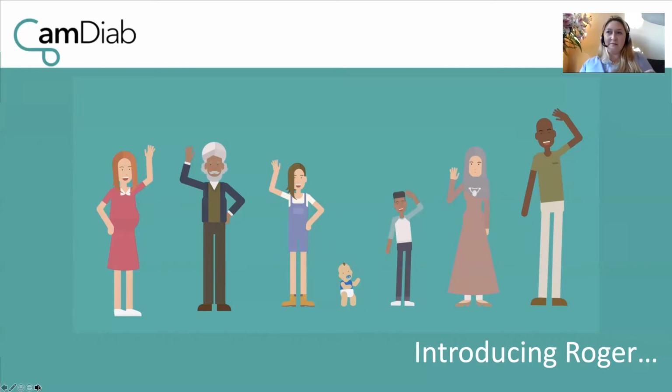At the beginning of the study, for all those kids that went on straight from diagnosis, they'd obviously had a period of time on injections and learned how to glucose monitor. But because the system is pretty robust and it doesn't fail very often, there is that worry: have they got the skills to manage if it does? All we can do to mitigate those risks is make sure that at each clinic appointment, at every opportunity, we have those reminders and build in some ongoing training and support, so that if that does happen, they know what they need to be doing. I don't know if anyone else has got any thoughts around that.